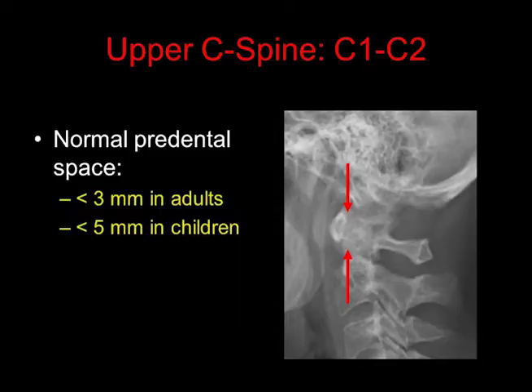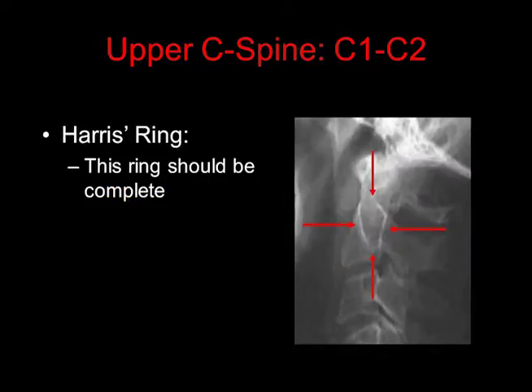The normal pre-dental space is the space between the anterior arch of C1 and the anterior aspect of the dens. This space is less than 3 mm in adults and less than 5 mm in children. Always look at Harris' ring — this is a ring that's superimposed over C2, and it should be complete. If it's incomplete, suspect a fracture.